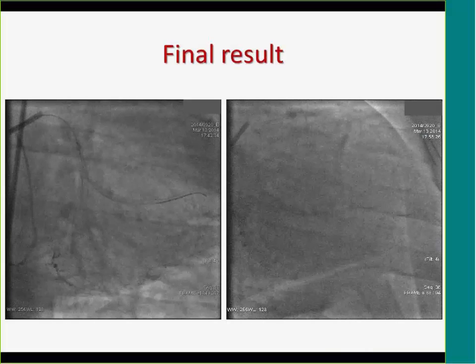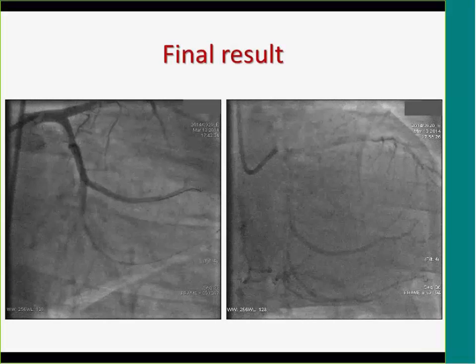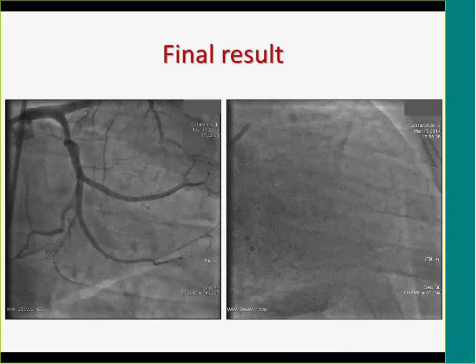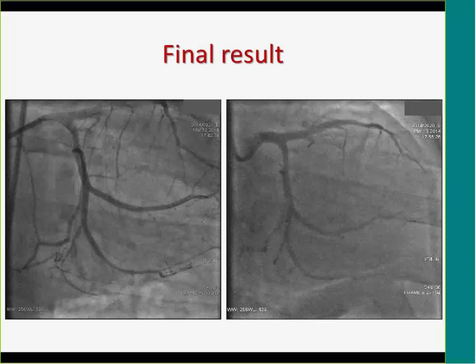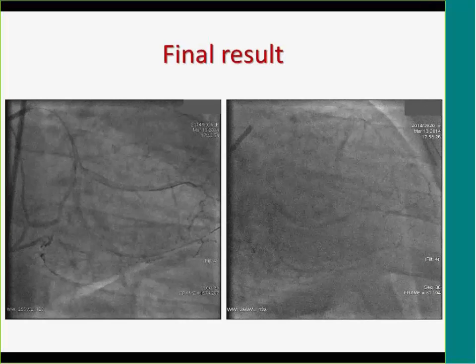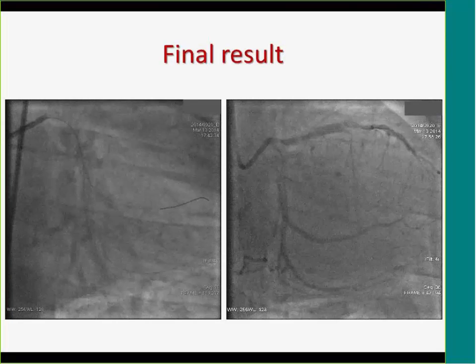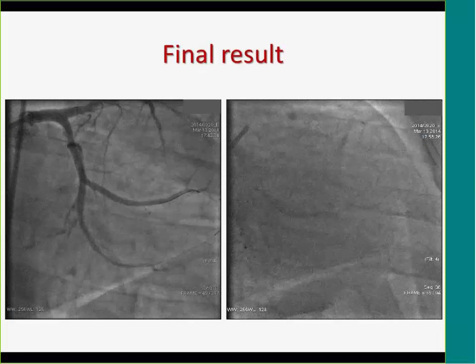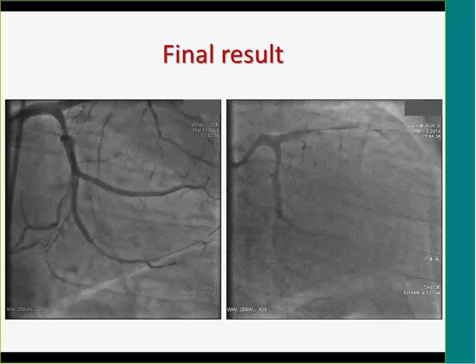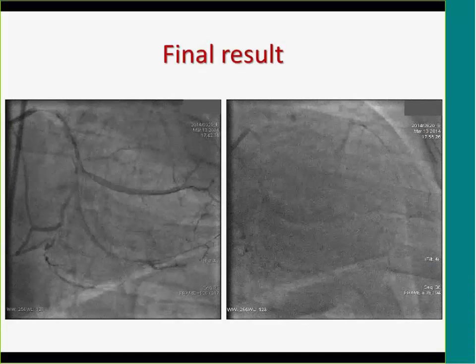But to be true, the stiffness of the Confianza helped us a little. But it was really, really difficult. So I think that in this case, a ping pong guiding and the trapping of the wire would have been a better strategy.